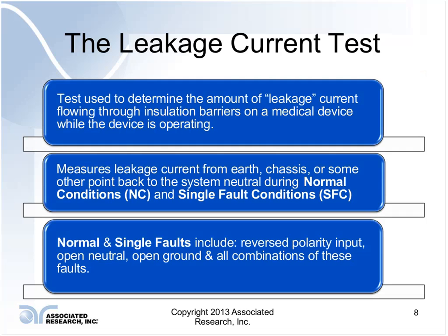And we say leakage because we're talking about current that's flowing in the insulation itself. It's almost the same thing as a capacitor, really, because when current is flowing through a capacitor, we're talking about a dielectric material. Well, insulation is a dielectric material. We want to know exactly how much current is flowing through the insulation, because we use insulation in products to separate different conductive materials.